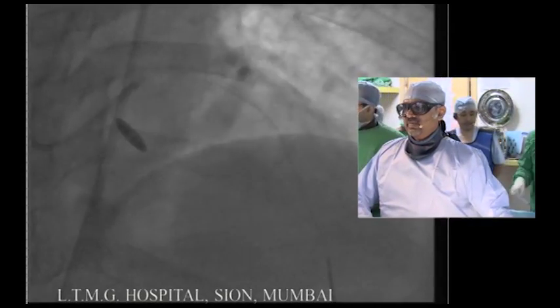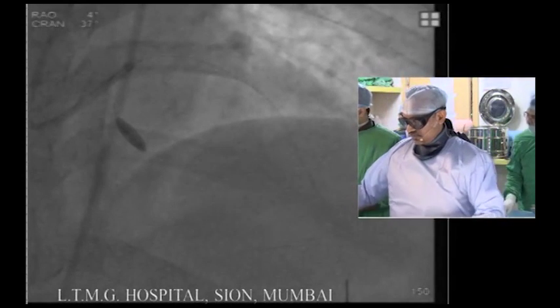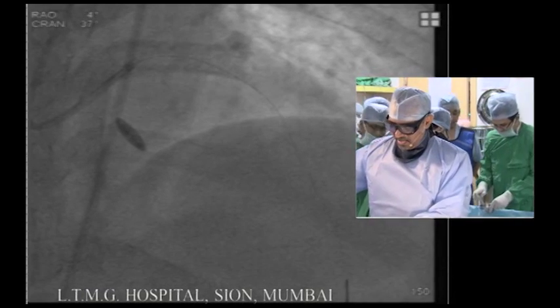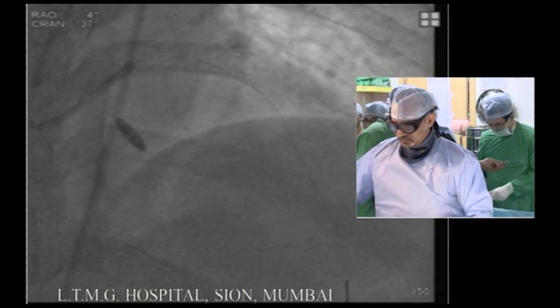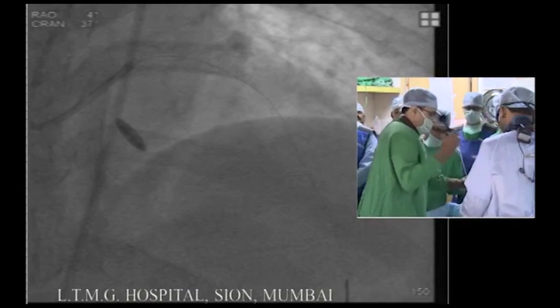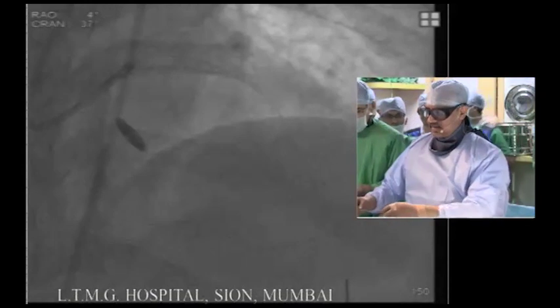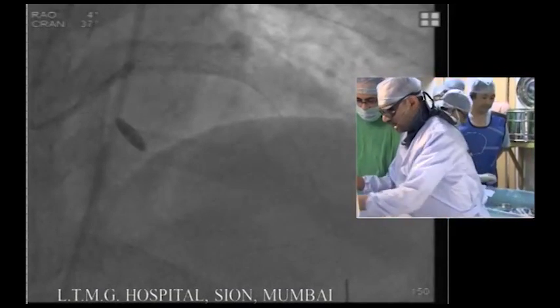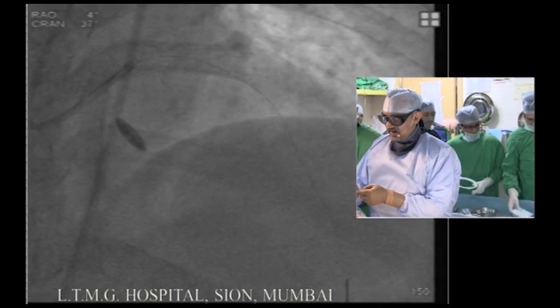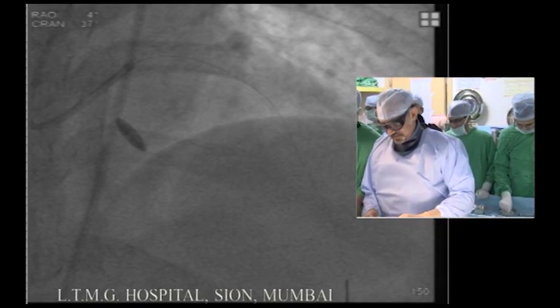So Dr. Mahajan, even though Dr. Hamadaki said that, the panel votes for pre-dilation first. Okay, then I will go for pre-dilatation. I think you are going to make the case longer by cutting corners if you don't pre-dilate before IVUS, because your IVUS may not go in. So I would take a small balloon. That is the main concern: IVUS may not go, and there will be some problem related to ischemia after putting in IVUS. So I don't want that. So pre-dilatation, stenting, and then post-stenting we will do the IVUS after post-dilatation for optimization.